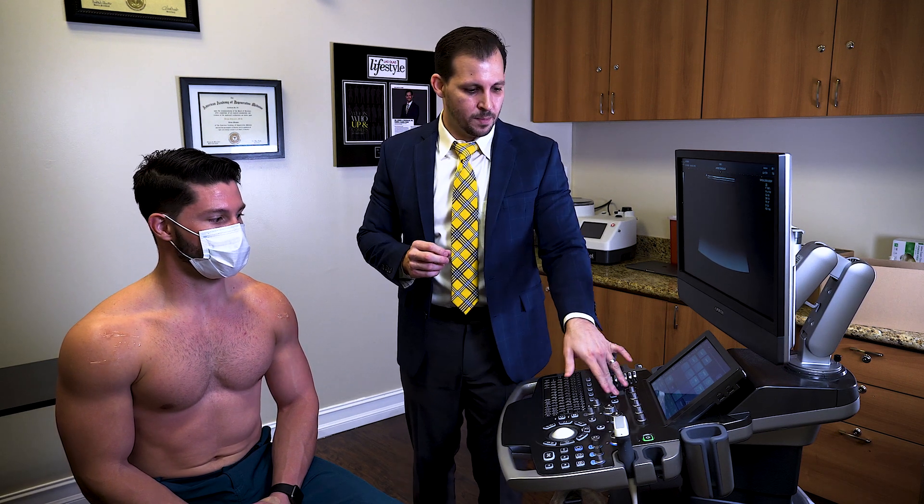Hello guys, today I wanted to show you how to properly diagnose using ultrasound guidance and look at the infraspinatus of the shoulder. In the same image we could look at the posterior glenohumeral joint, and sometimes we could also see a portion of the labrum with the same approach.